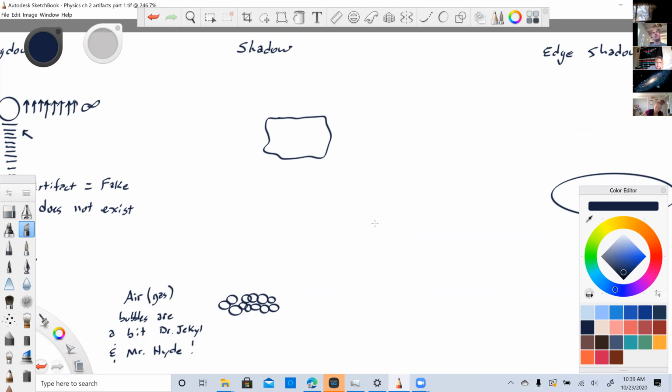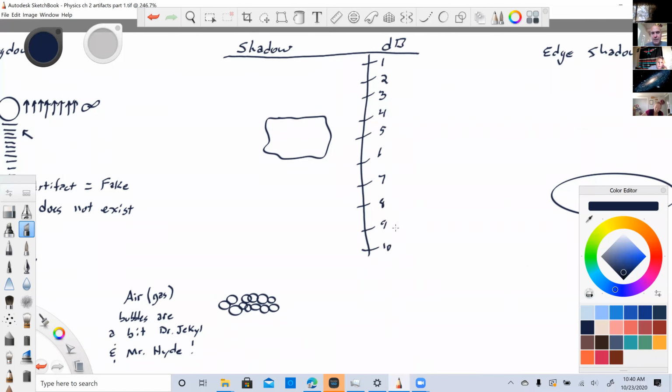In fact, let's just make my numbers really easy. I'm just going to put a little hash mark here. We lose every one of these hash marks. This is going to be decibels, 1, 2, 3. We can call it -1, but it's attenuation, so you should know that. Normally, we would expect a constant attenuation through the tissue. Every hash mark, 5, 6, 7, 8, 9, and 10. So by the time we get down to here, the machine assumes 10 decibels of attenuation.